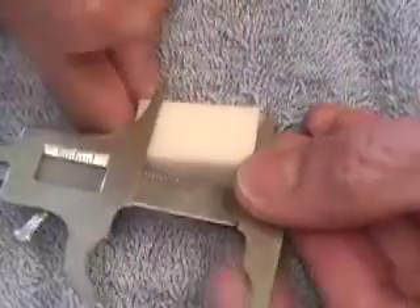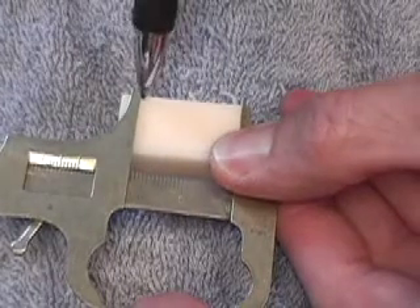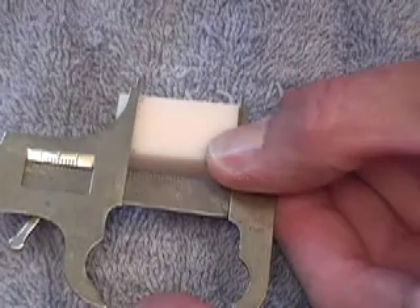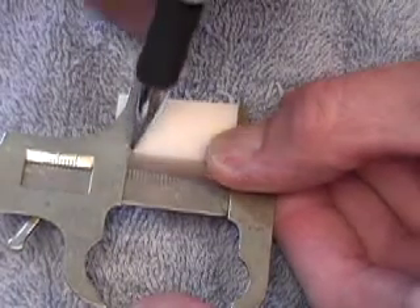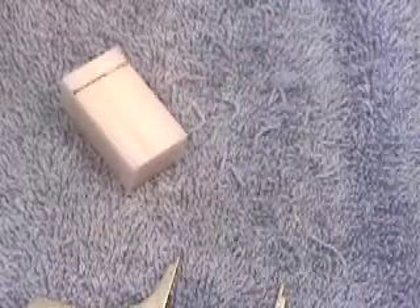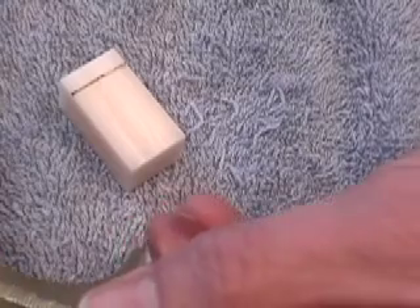First we'll make our initial cuts. I've set my micrometer to just a half a millimeter longer than the prescribed length, so instead of 25.5 it'll be 26. I'll mark the wax. And instead of 9 facial-lingual, we'll set up 9.5.